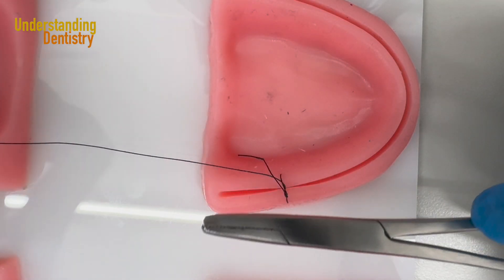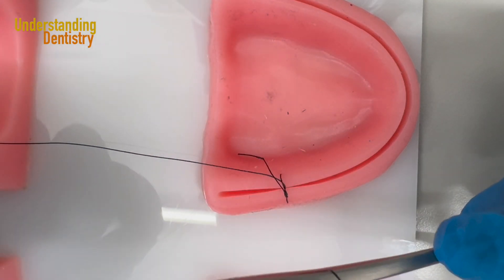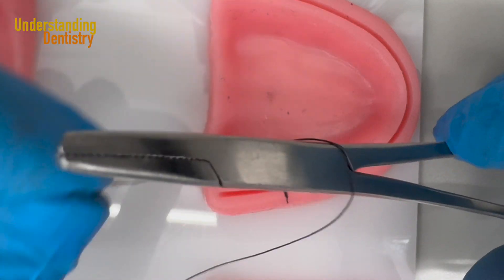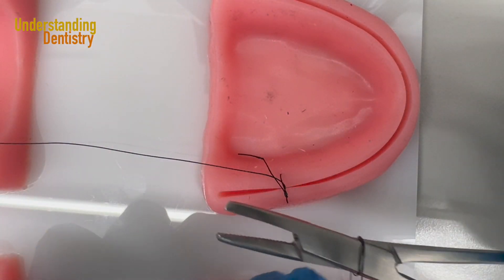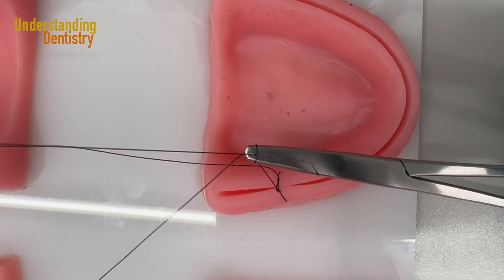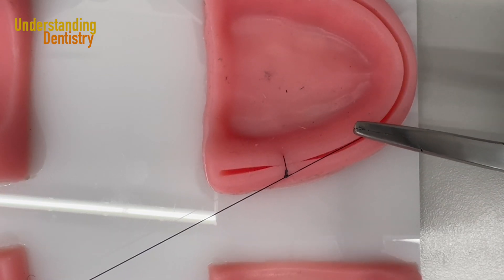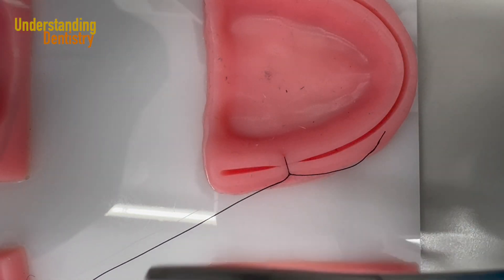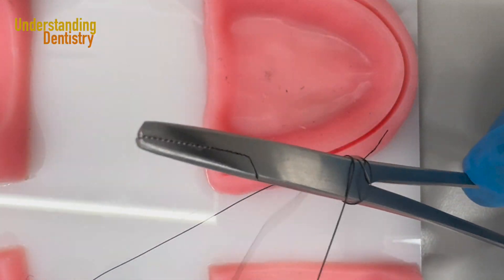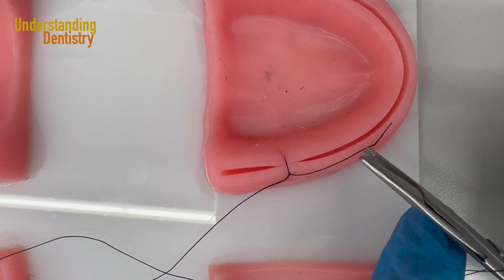There are different accepted theories, but the way I do it: I do two rotations, then one, then one. So I did two rotations with the thread around my instrument, now I will do only one — still clockwise. I capture the tip of the thread again and finish the suturing procedure. I pull stronger and then the last one I do counterclockwise to lock the knot.